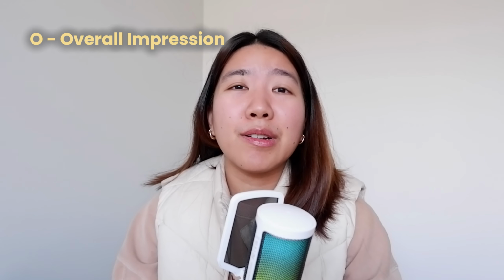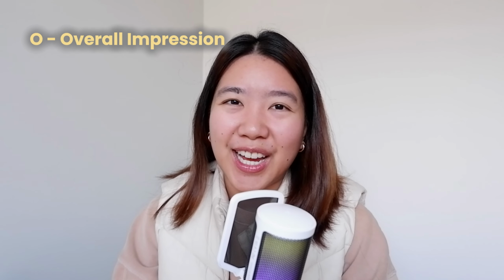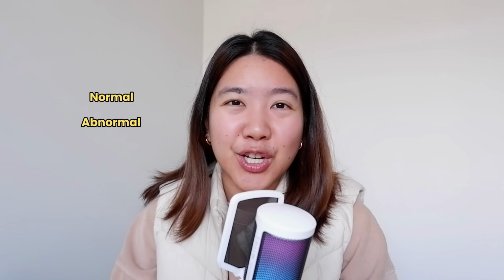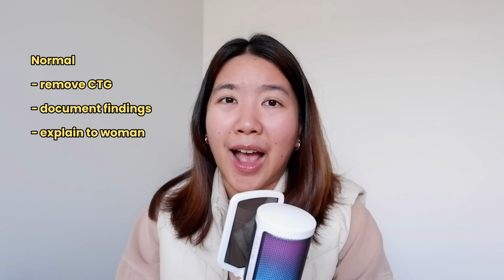Overall impression. So after going through all features, it's now time to summarize your CTG. In Australian clinical practice, we classify it as a normal or abnormal CTG, and then you need to know what you are going to do next. If it is a normal CTG and she's antenatal, not contracting, not in labor, then you can remove the CTG, document your findings, and explain to the woman what you found.